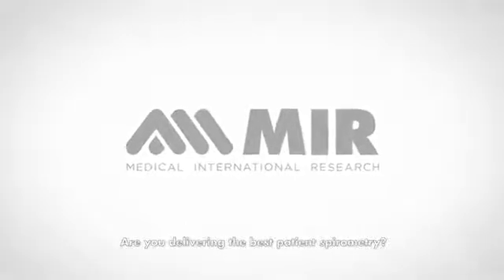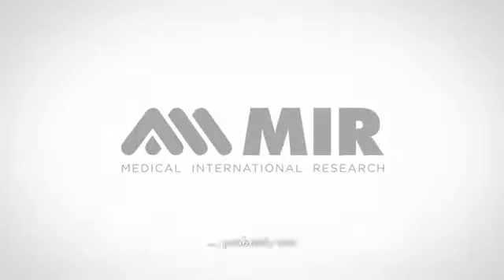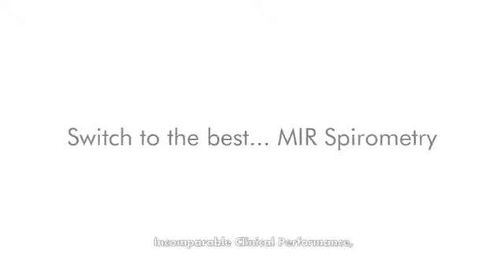Are you delivering the best patient spirometry? Probably not. Switch to the best — MIR spirometry. Incomparable clinical performance.